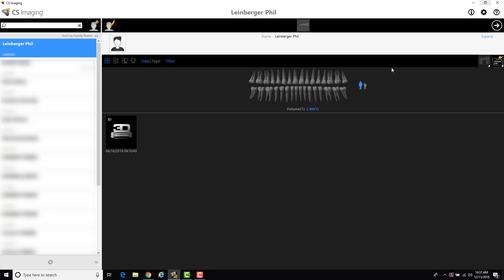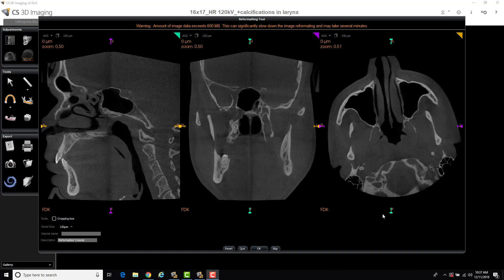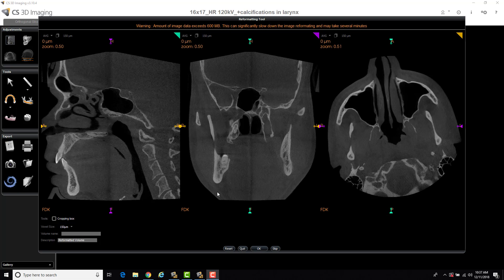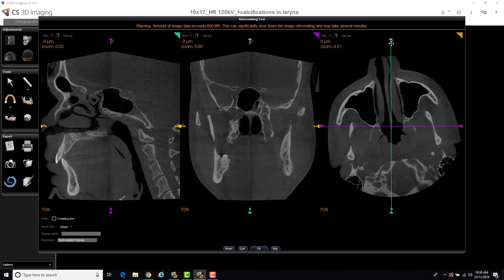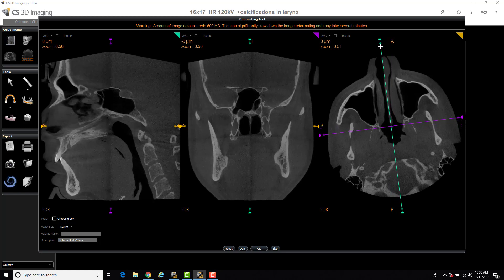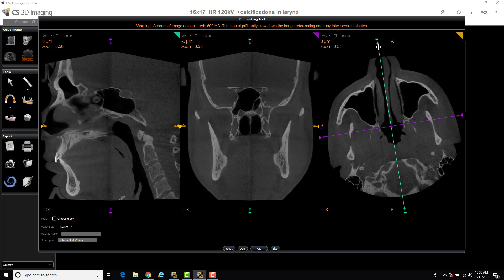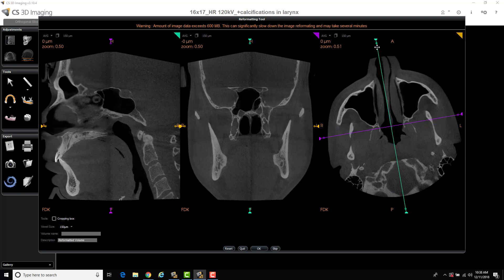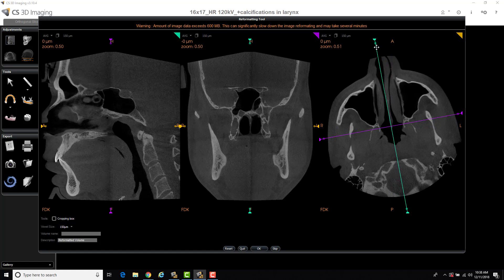Close the scan and reopen the scan. What you're going to get is this reformatting toolbox, and you can see you've got the three different views: axial, coronal, sagittal. And on my axial view you can see how it's tilted. So to straighten out the image, you're going to simply grab my teal movement handle and then reorient the scan like so.